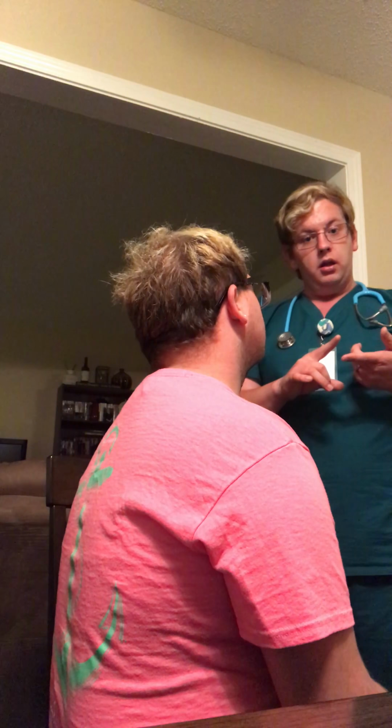All right, today we're going to be doing our lung assessments as well as administering an albuterol inhaler. We're first going to be doing the lung assessment. All right, first I'm going to just take a glance at the front here and make sure there are no abnormalities as far as anything that I can see. It all looks pretty symmetrical. I don't see any abnormalities.